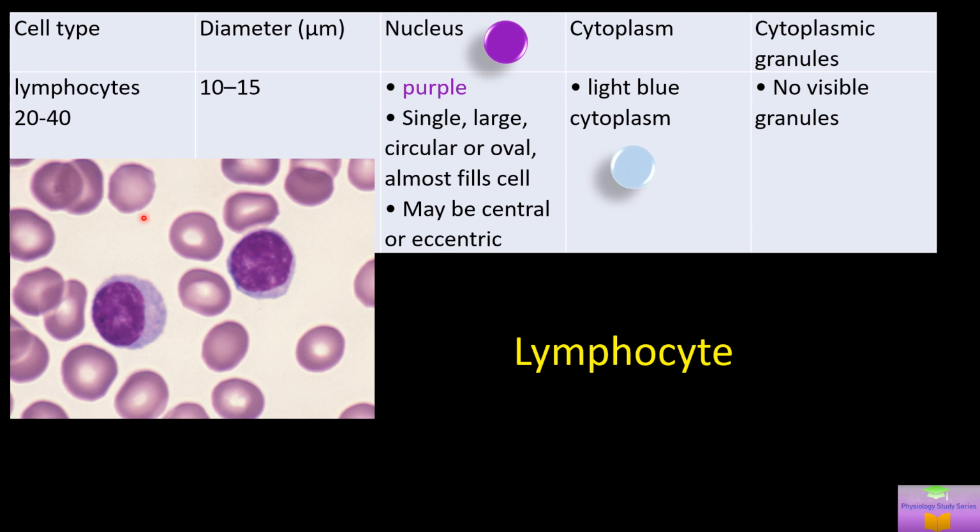There is another subset of lymphocytes which are smaller than the regular lymphocytes. The size of small lymphocytes is similar to the size of an RBC, with the same characteristic features of cytoplasm and nucleus of a large lymphocyte.